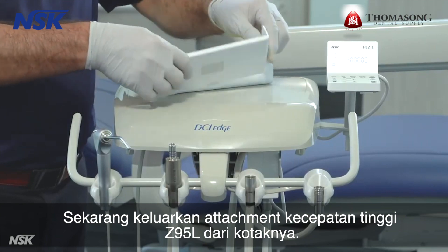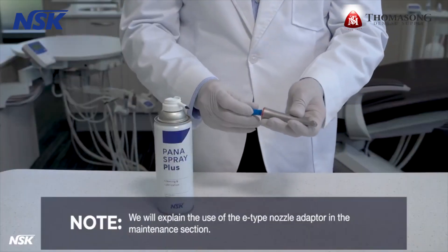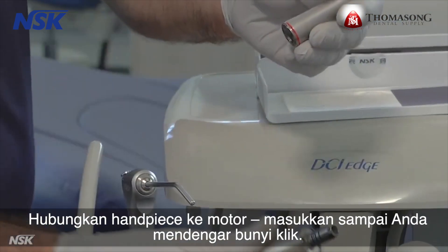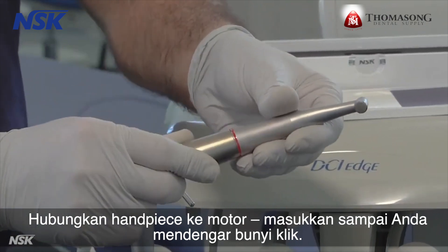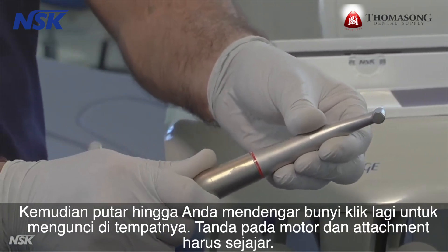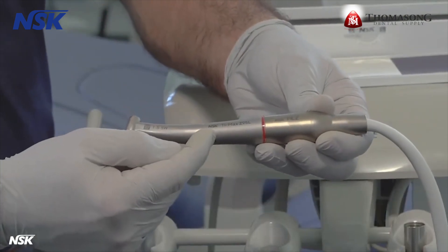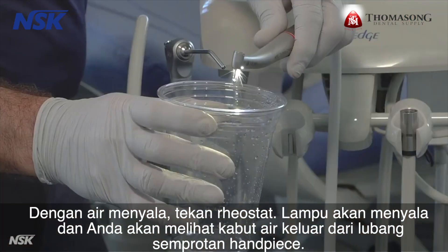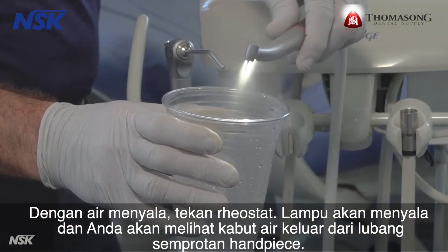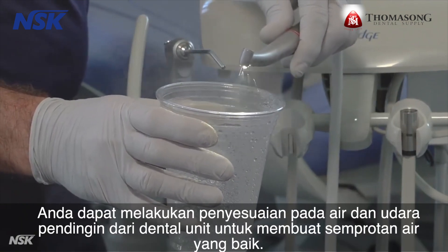Take the Z95L high-speed attachment out of the box. Note: we will explain the use of the E-type nozzle adapter in the maintenance section. Connect the attachment to the motor — insert it until you hear a click, then twist until you hear another click to lock in place. Markings on the motor and the attachment should line up. With the water on, press the rheostat. The light should come on and you should see a water mist coming out of the spray holes of the attachment. You can make adjustments on water and coolant air of the delivery unit to create a good water spray.